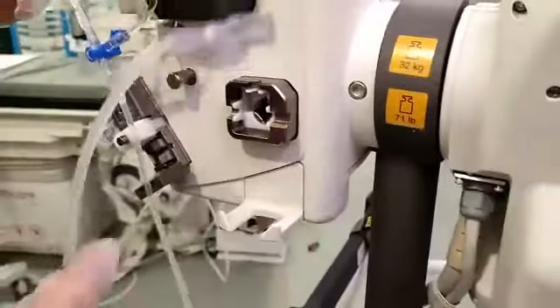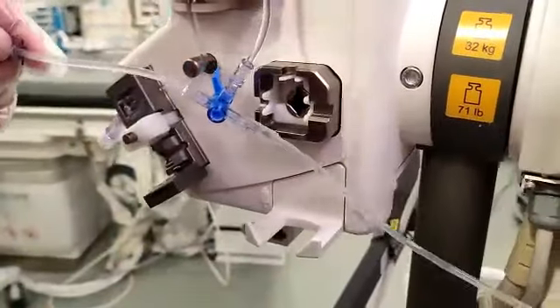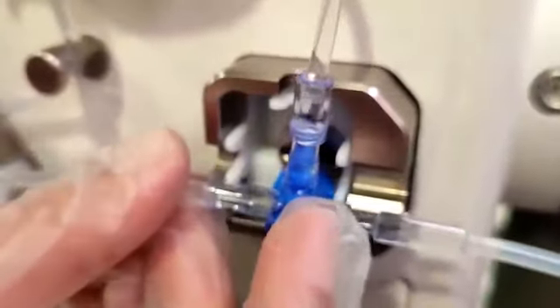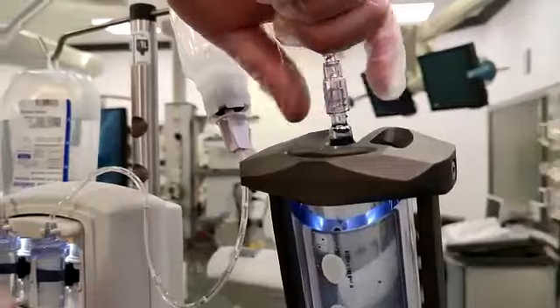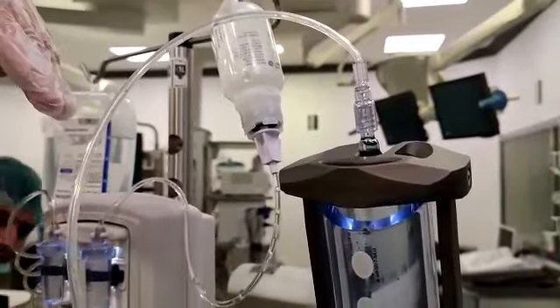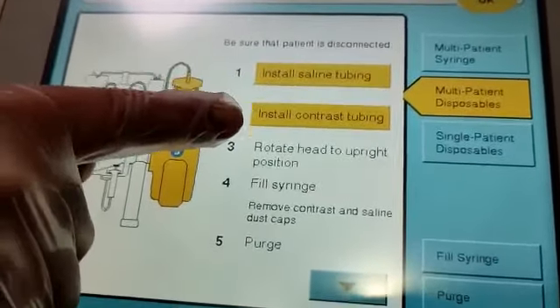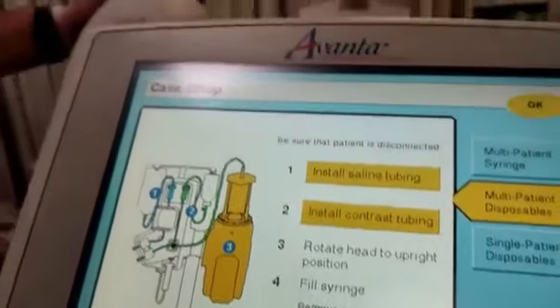Once you fill the chambers manually, come back here. This side should go to the syringe and the other side should go toward the patient. There is a three-way stopcock — make sure it is in the correct position; this injector will not work if it is not installed properly. For the contrast syringe tubing connection, once you attach it, rotate it to lock and tighten it, and remove any air. If it is loose it will take in air.